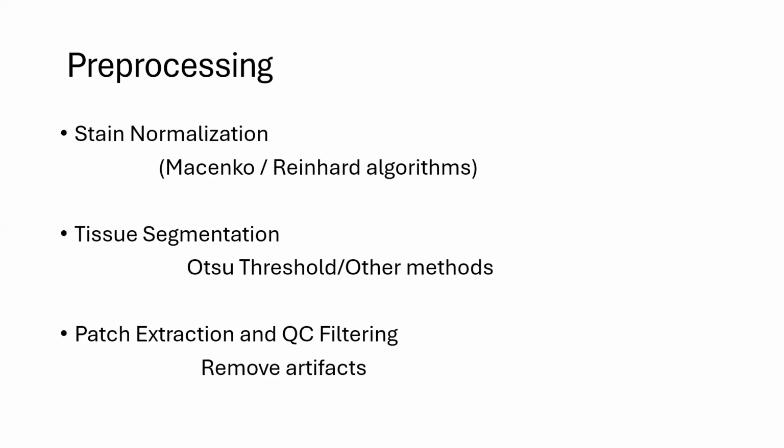And there are a lot of algorithms like HistoQC, GrandQC, and HistoSweep. So many algorithms are available, and more things are to come. HistoSweep is a state-of-the-art kind of algorithm because it was developed by a pathologist. They analyzed different types of tissues and found filters, like ordinary image processing filters.